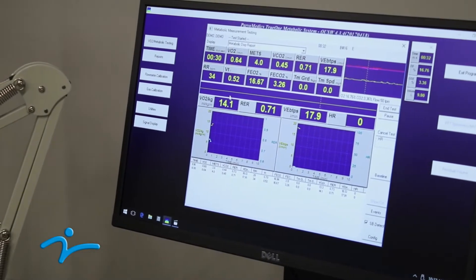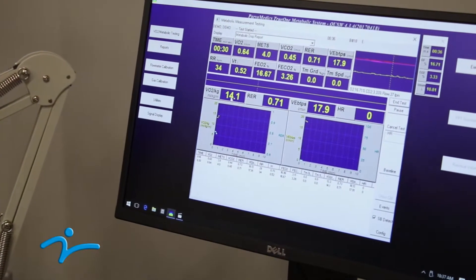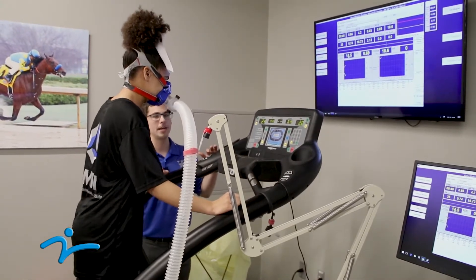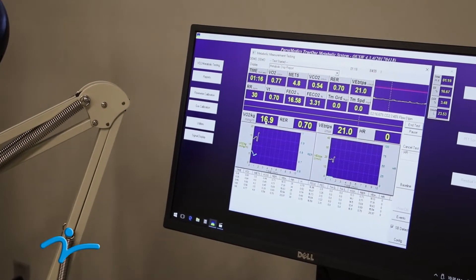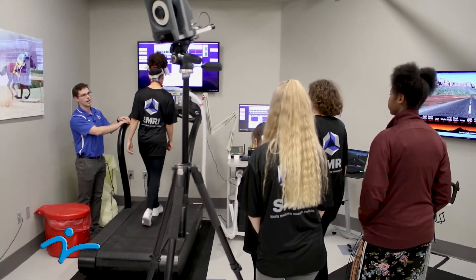Over here we can see how much oxygen she's breathing in — so liters per minute — and then we can see how much oxygen she's breathing in relative to her body weight. As we increase the incline a little bit it's gonna require more oxygen, so we should see her value on the screen go up just a little bit. It gets harder and harder as you're going and eventually you reach a maximum value, and that's your VO2 max.